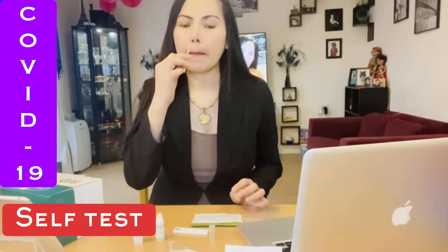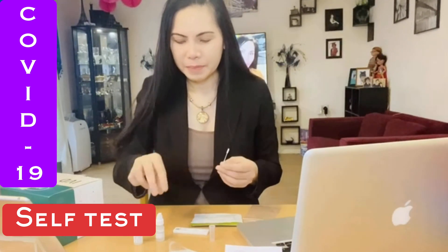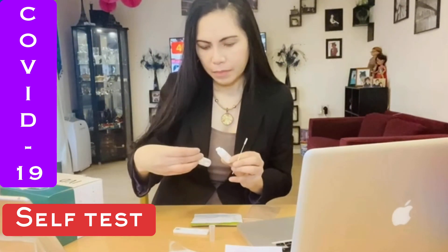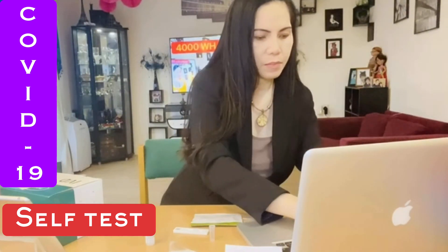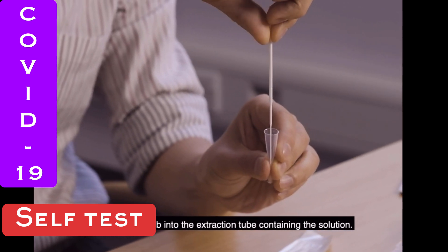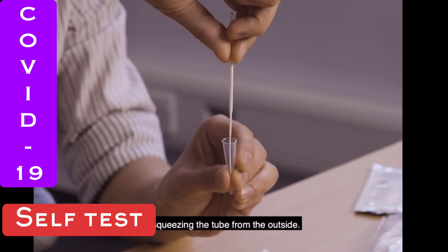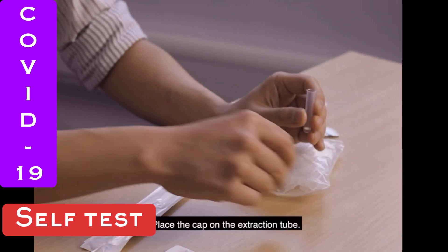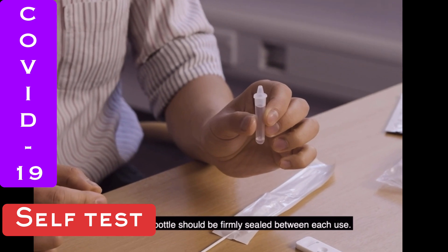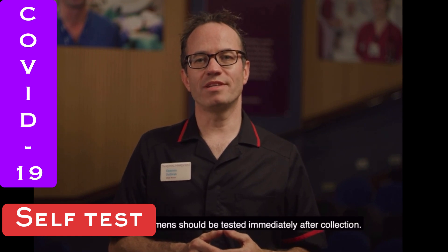Insert the swab into the extraction tube containing the solution. Swirl the swab tip in the solution fluid against the wall inside the extraction tube, squeezing the tube from the outside. Then place the cap on the extraction tube — the solution bottle should be firmly sealed between each use. Once the swab is done, we begin the test process. The swab specimen should be tested immediately after collection.